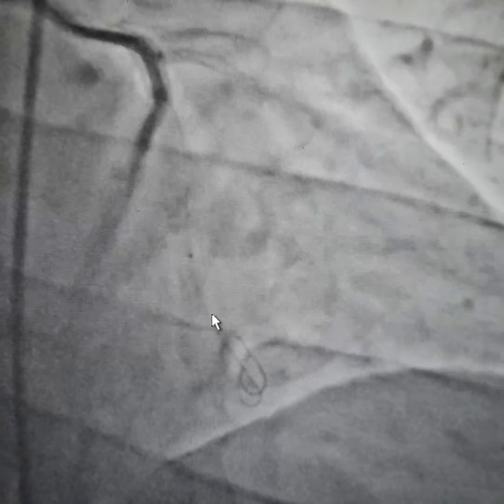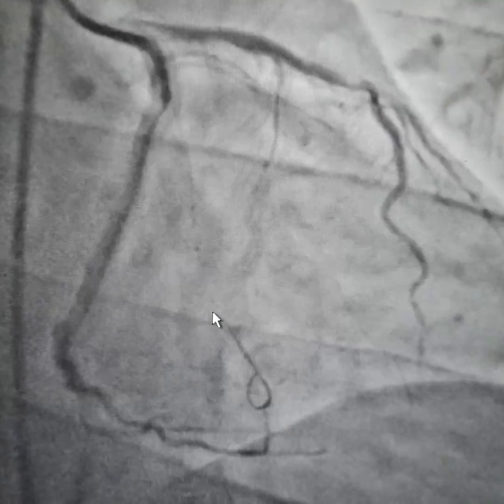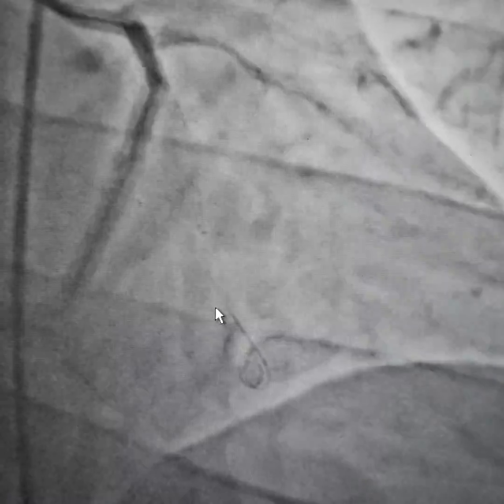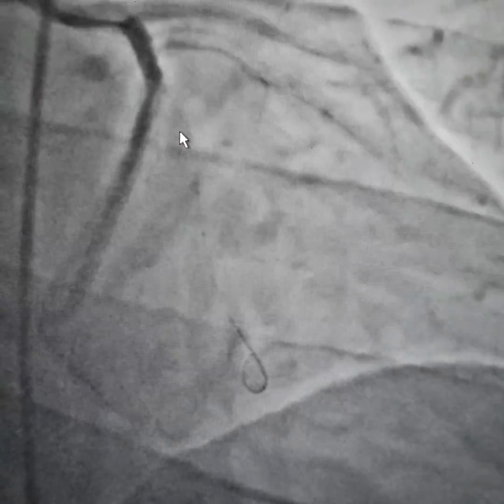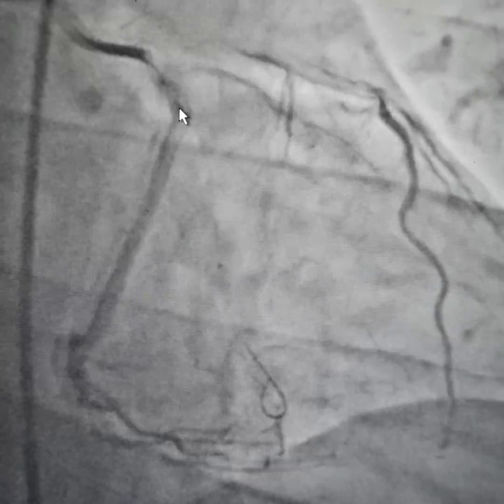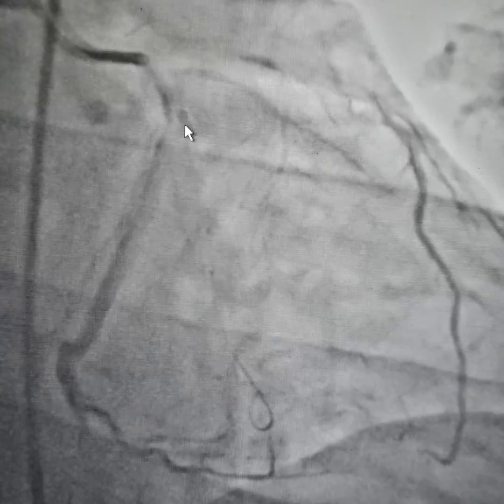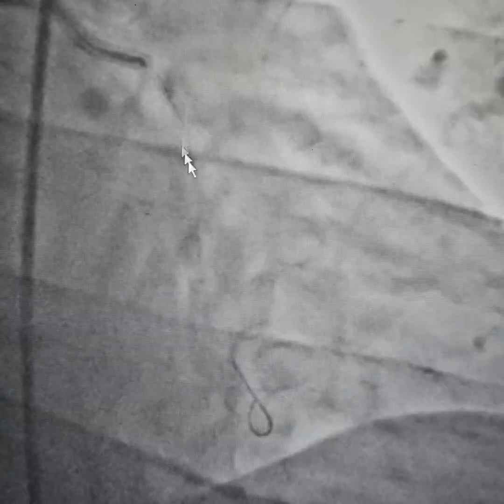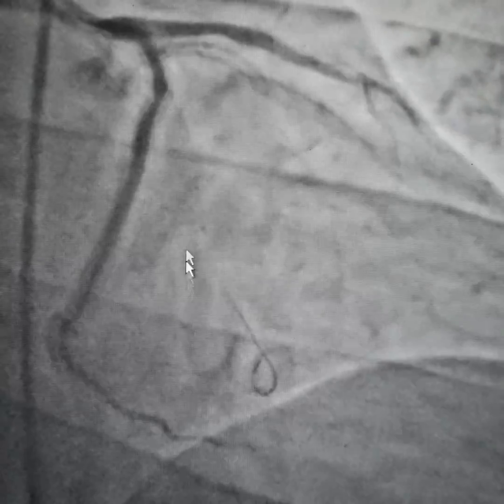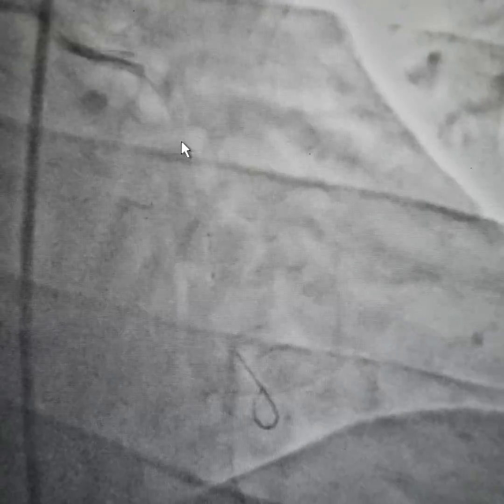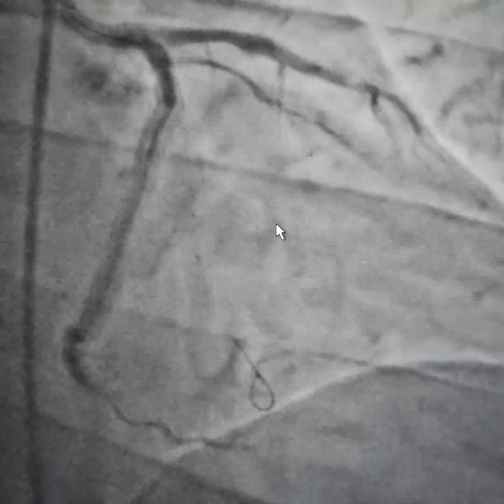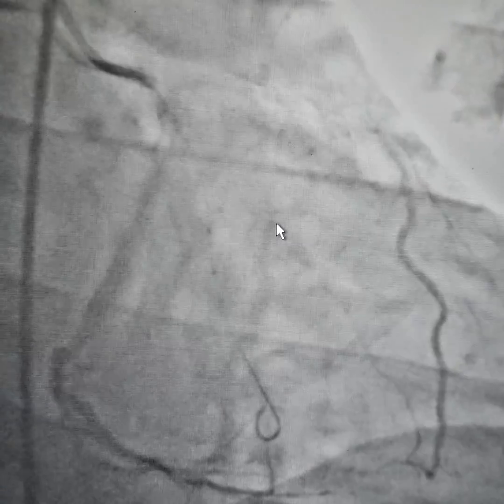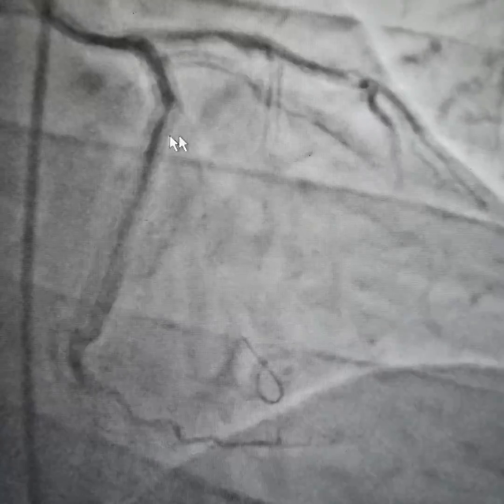We're going to talk about angioplasty and understanding of acute inferolateral wall MI caused by a hundred percent occluded major obtuse marginal artery. We did the angiogram and we saw the obtuse marginal artery was a hundred percent occluded.